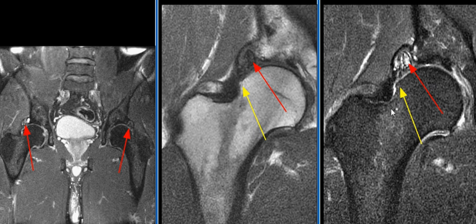MR findings are consistent with os acetabuli and femoral acetabular impingement.